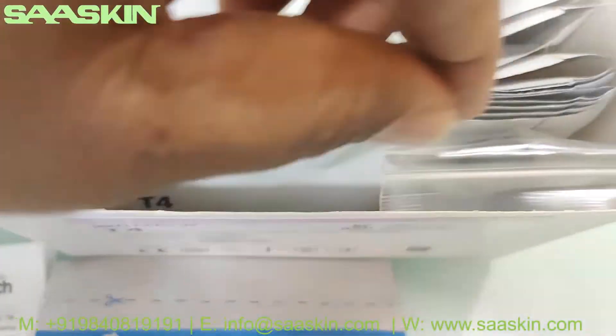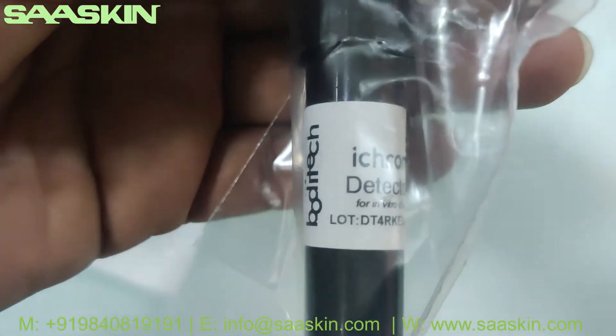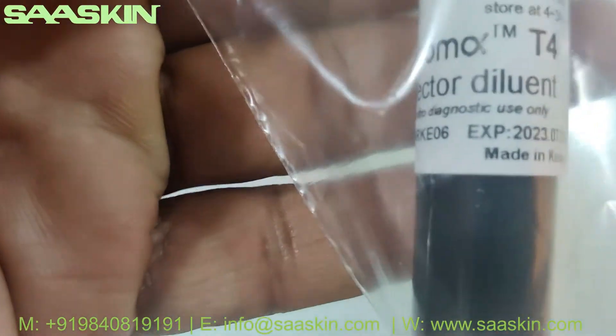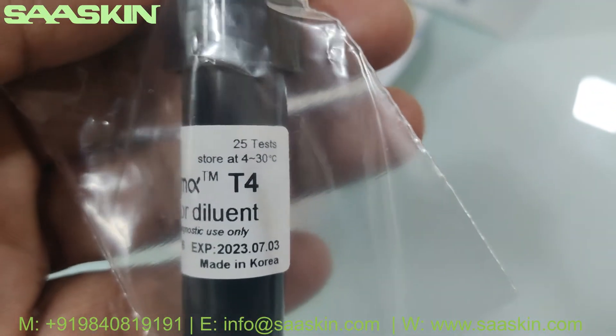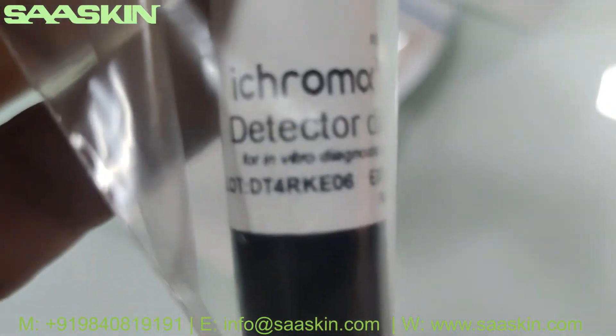Further inside you can see there is one dilution buffer bottle. It says it is for 25 tests — ICHROMA T4 detector dilution buffer.